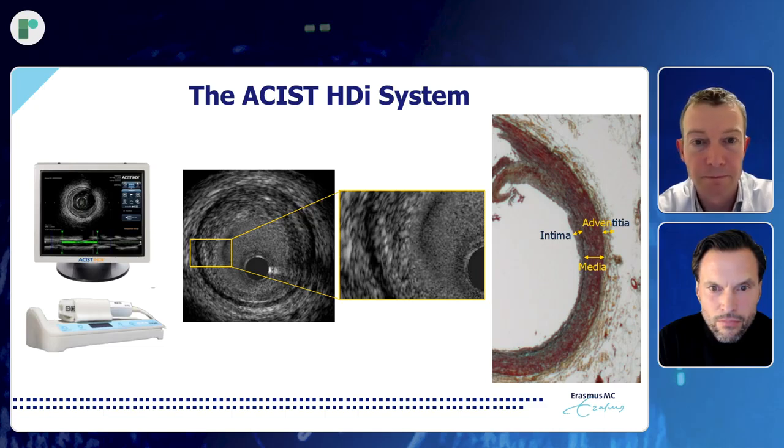Before we go to the next session, Christoph, any thoughts from your side on where you think pros and cons exist between IVUS and OCT? Any particular preference or any specific insights on which cases may or may not benefit from IVUS? No, I think it's important to have, for your cath lab and your specific procedure, a default strategy.